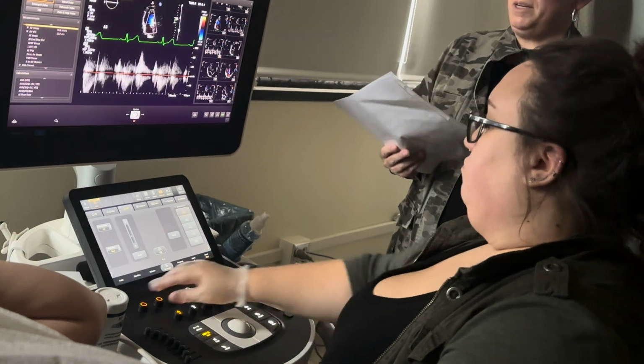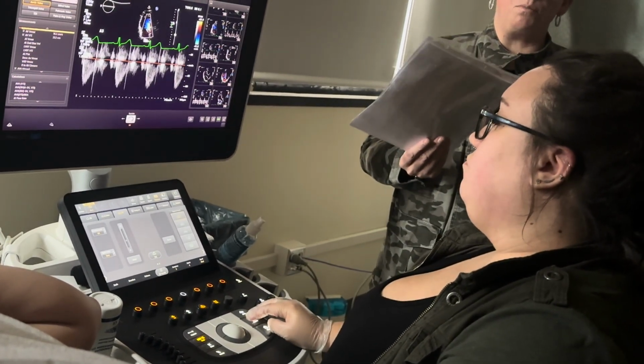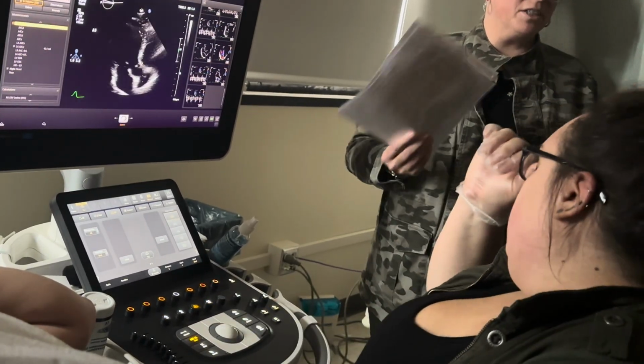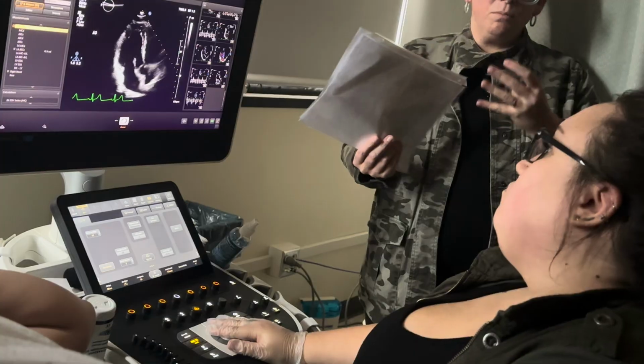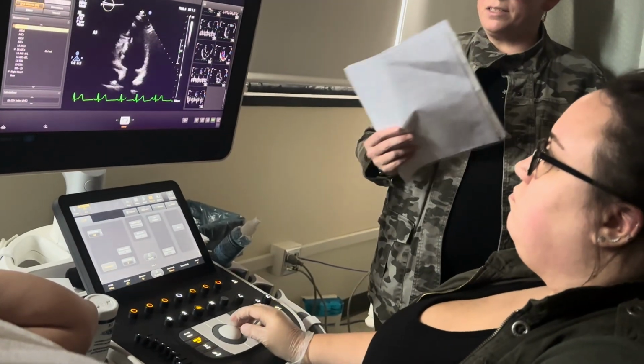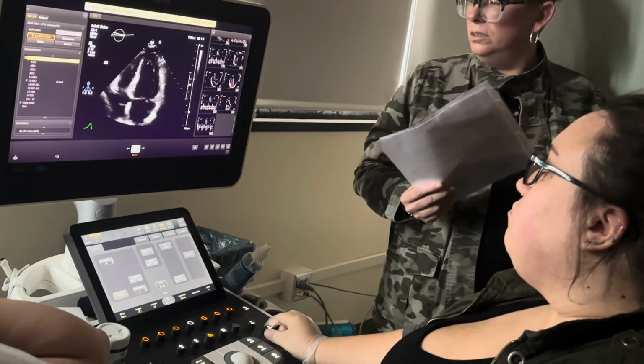So this is basically us trying to see that you know which way the blood flow is supposed to be going. You know that that's for the mitral valve. You know that's for the aortic valve, that it goes the opposite way. You know that the pulmonic goes the opposite way during systole. We're just trying to see that you can turn these things on and figure it out. Anything else? That's it. Cool.